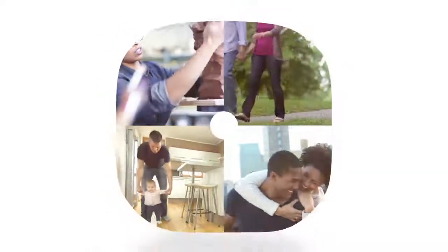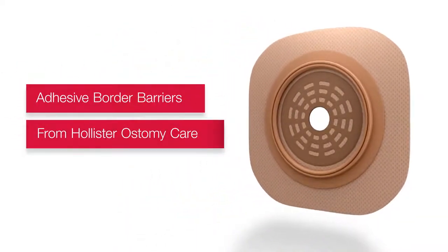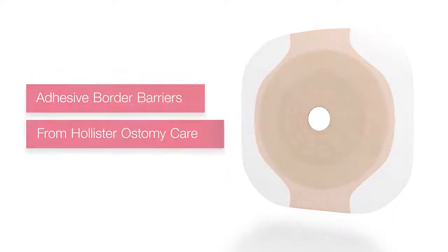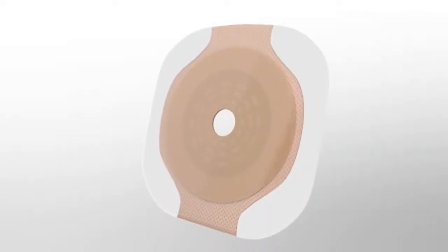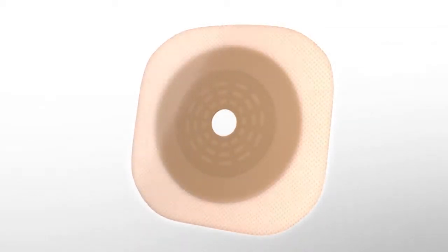Adhesive border barriers from Hollister Ostomy Care provide an option to help achieve optimal fit with confidence that's built right in. This confidence comes from the addition of adhesive that surrounds the hydrocolloid barrier, designed to be gentle on the skin while providing an extra sense of security.